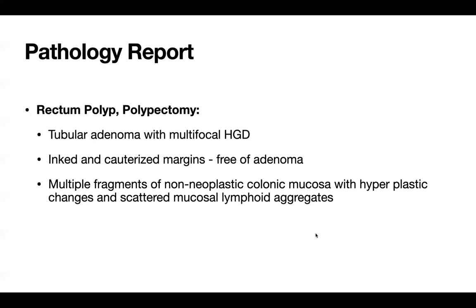The other time I put them in a separate container is when I do the resection and then there is a tethered area. Although I think that tethered area is from scarring from prior intervention, when I remove that with hot biopsy avulsion, I put it in a separate container for the pathologist to focus their attention to that small segment. Because if you put all of them in one bottle, they quickly scan through, versus giving a separate bottle will make them focus on that particular segment.